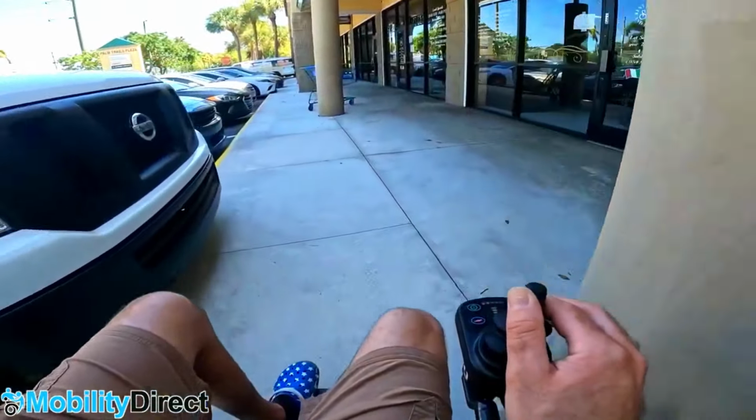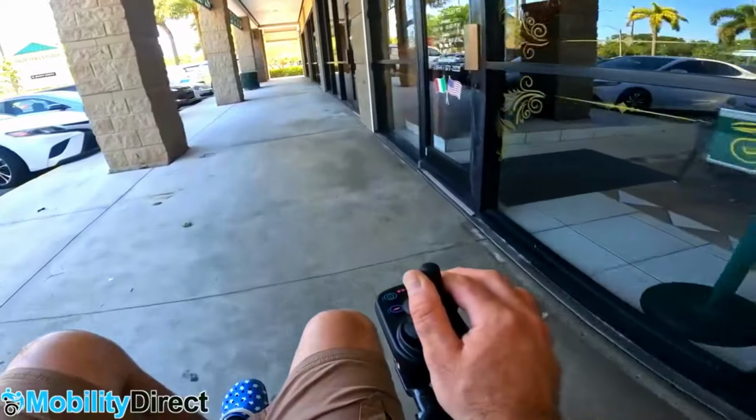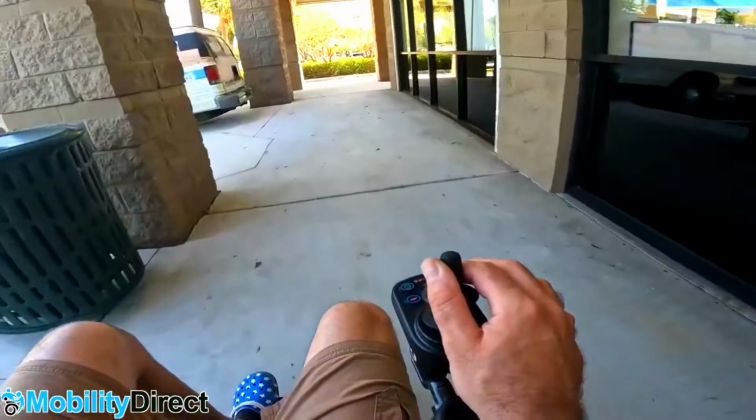This thing does go a little slow when you turn it. So like when you turn, it slows down a little bit. I think that's probably good because it's so lightweight. So when you're going straight, you'll get the full speed.